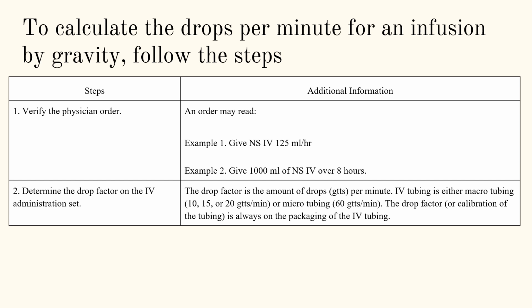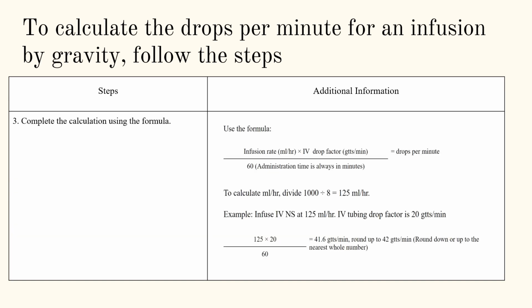We don't really do this anymore. This is very, very rare, but there are instances where you will see this, and it's more in home health than in the hospital. So this is the formula you would use to calculate how to do a gravity. So the formula is actually very simple.